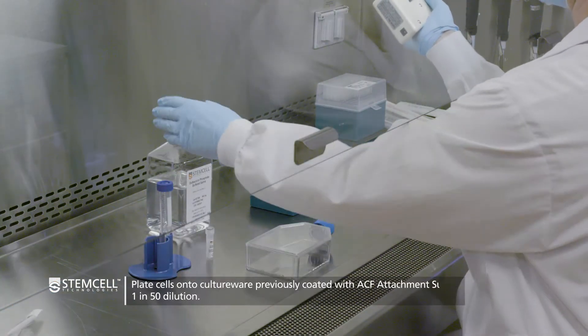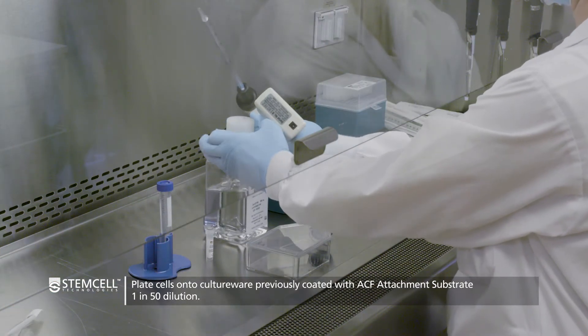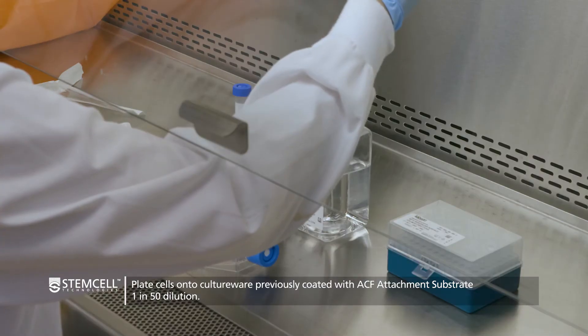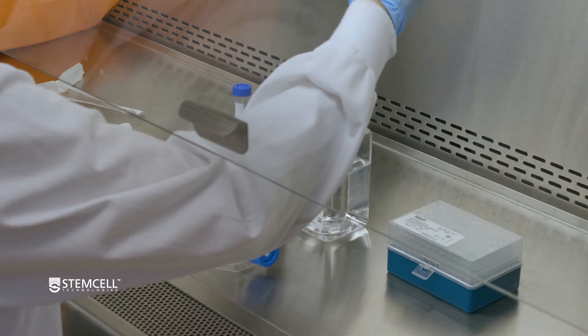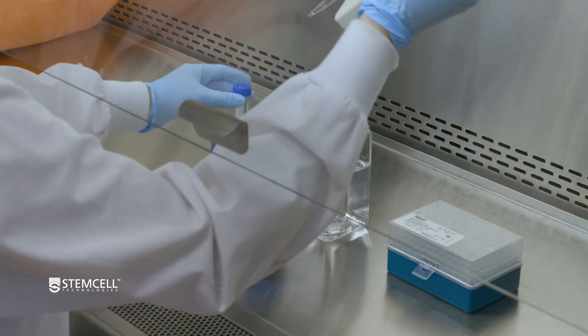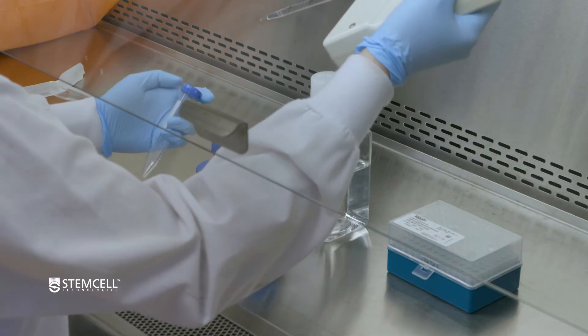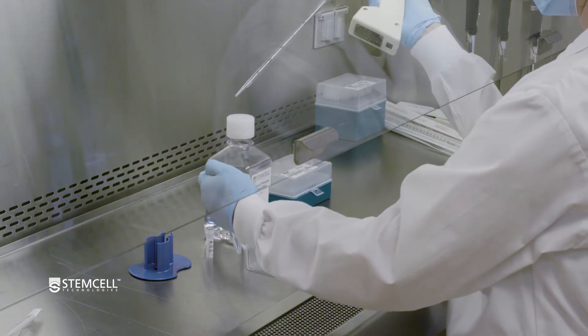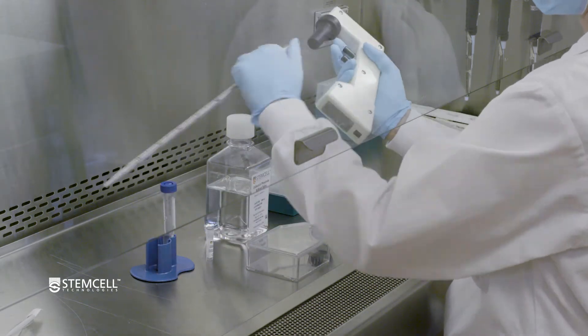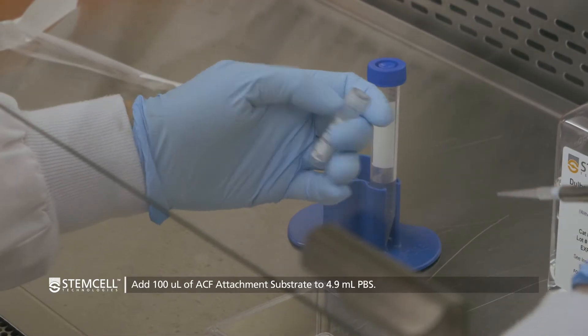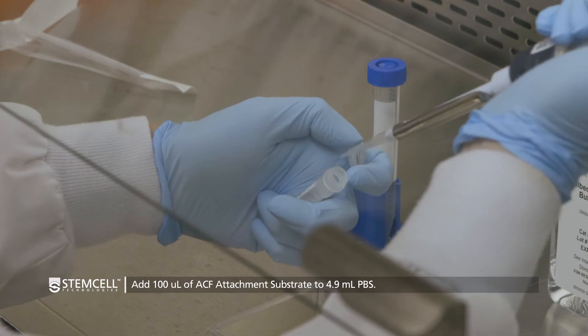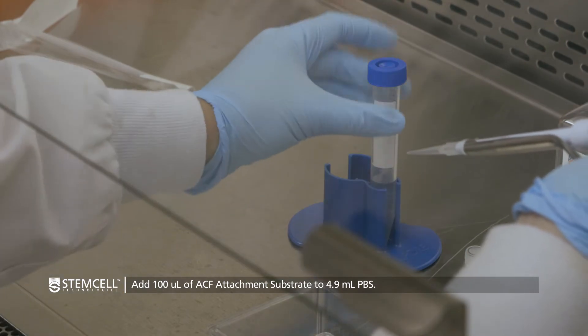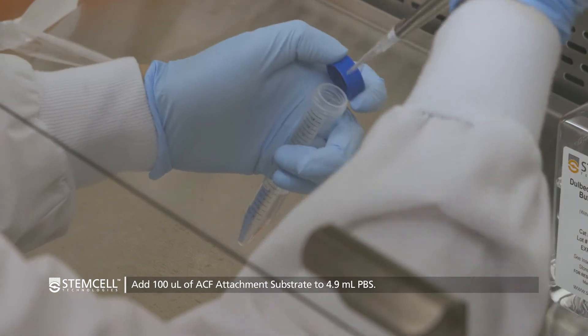Before you begin, coat the culture wear with ACF attachment substrate diluted 1 in 50 in PBS. To coat one T75 flask, add 100 microliters of ACF attachment substrate to 4.9 milliliters of PBS in a 15 ml conical tube.